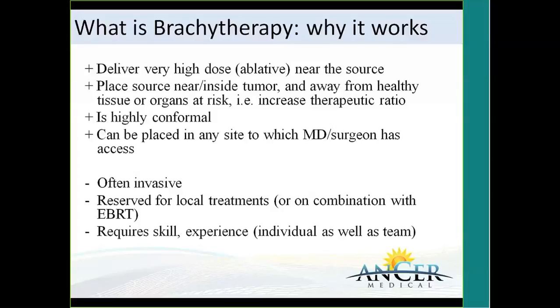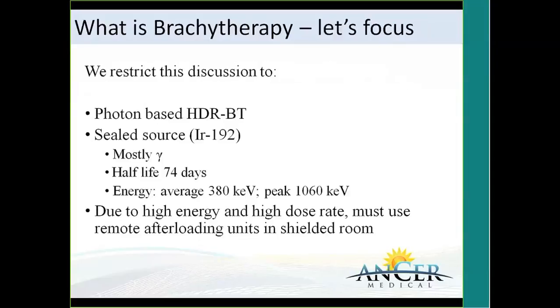So what you would often find is that physicians opt either to go with external beam or a combination of external beam and brachytherapy. What we're going to focus on is HDR brachytherapy, which is high dose rate brachytherapy. We're going to stick to units that are using iridium-192 sources.